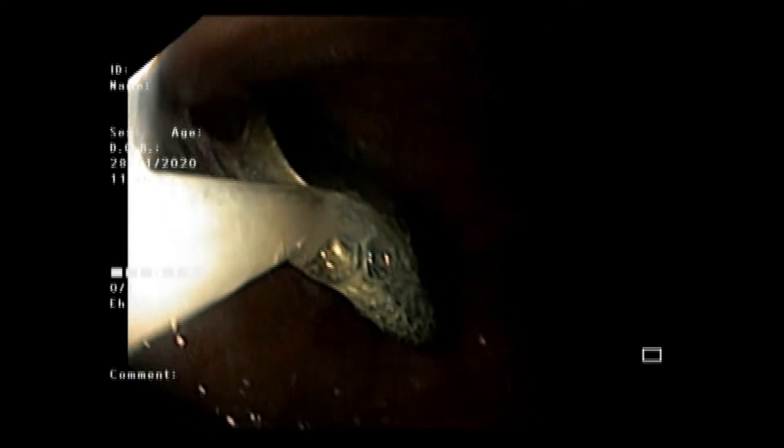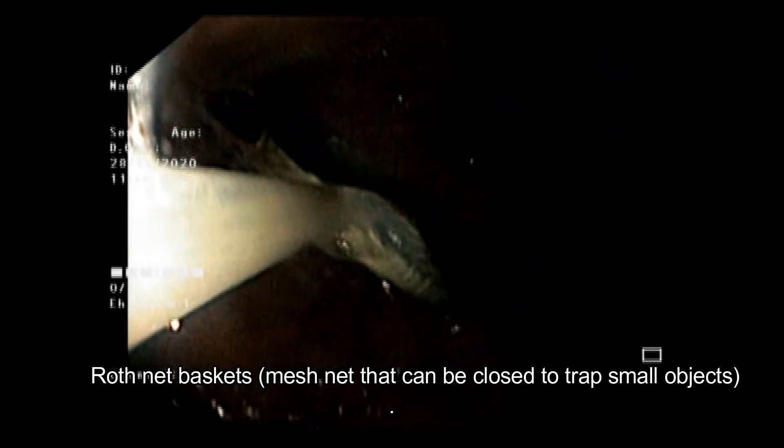The coin was an old large one and was only partially held by the Roth knitted basket. We then started removal of the coin through the endoscopic procedure.